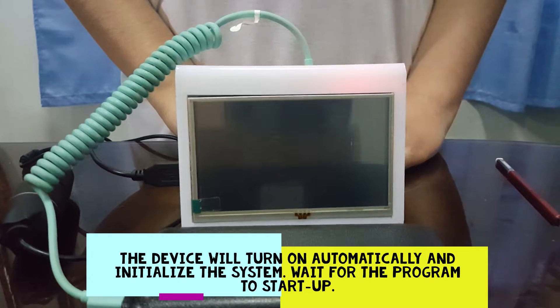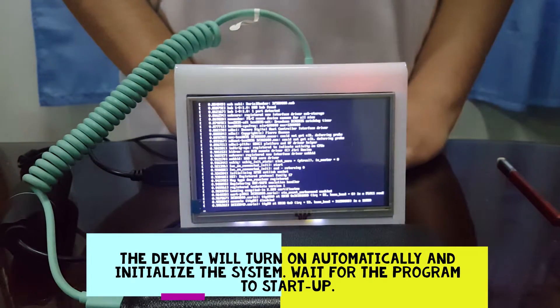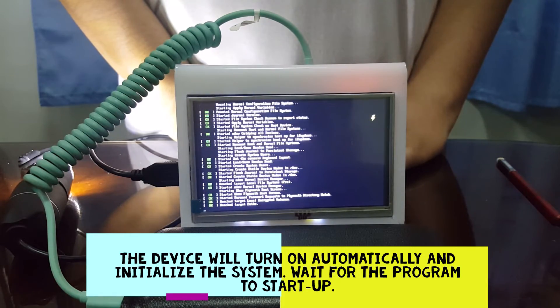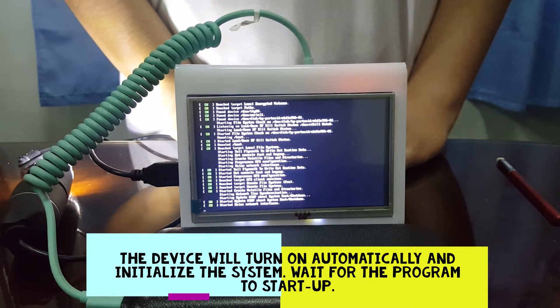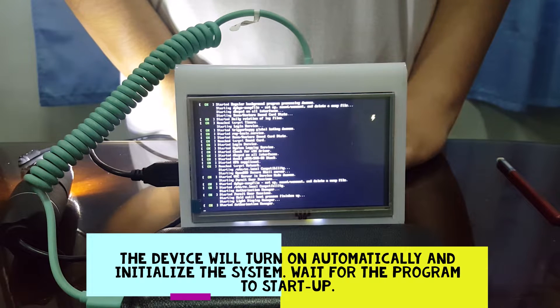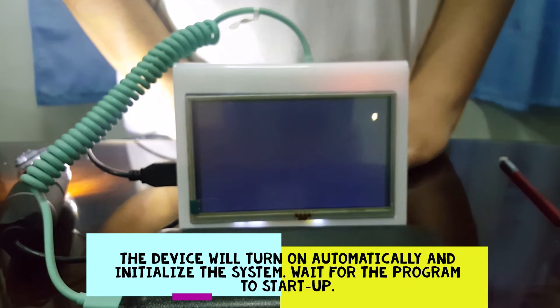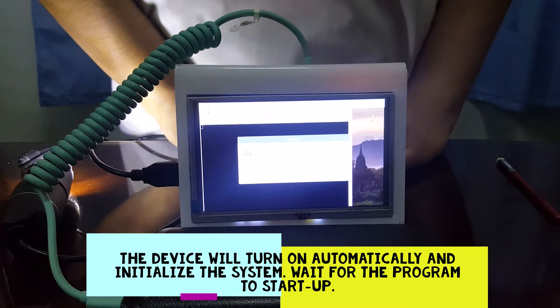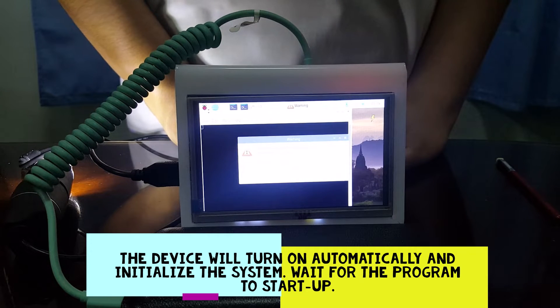The device will turn on automatically and initialize the system. Wait for the program to start up.